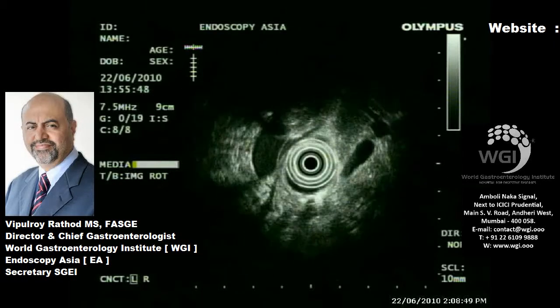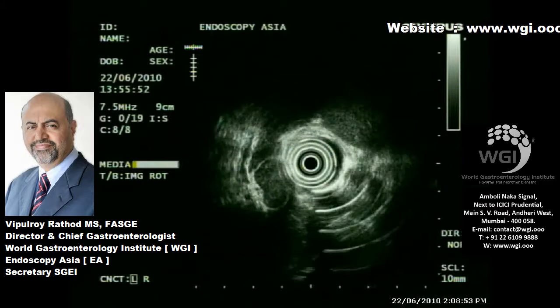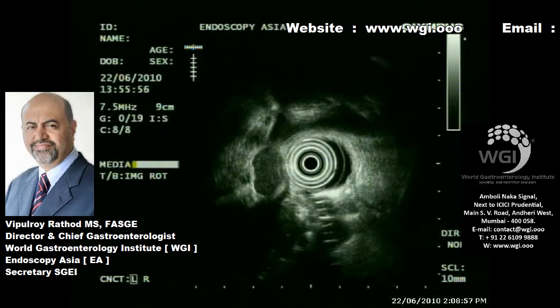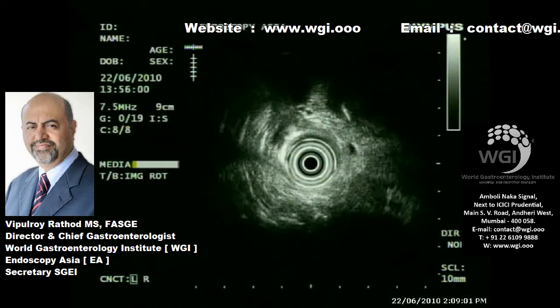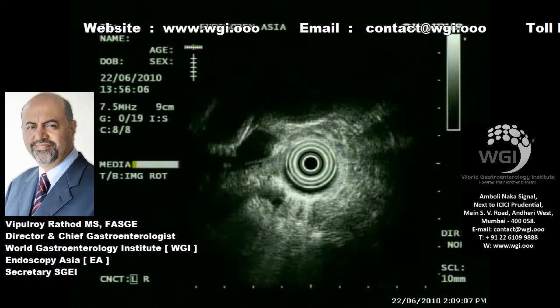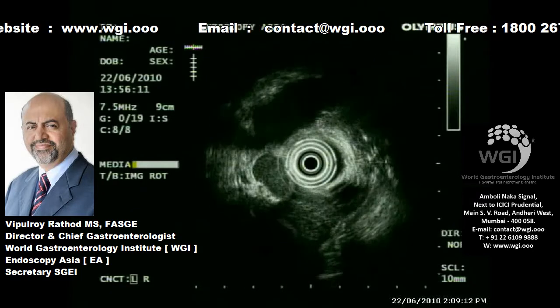An 82-year-old gentleman was referred to us with a suspected lower bile duct obstruction, secondary to a suspected mass in the head of the pancreas on other imaging studies. The patient was also referred to us for definitive staging in view of the mass.